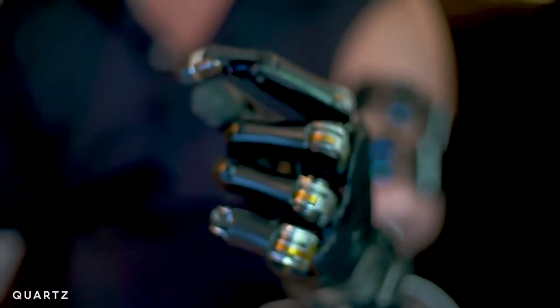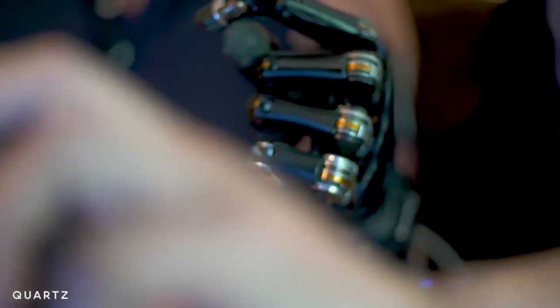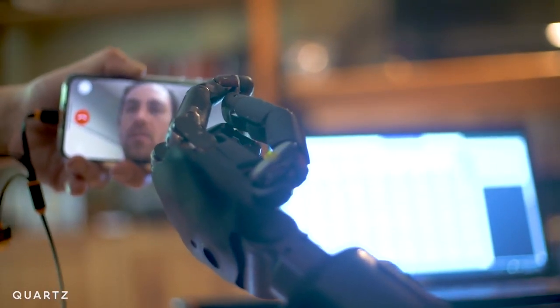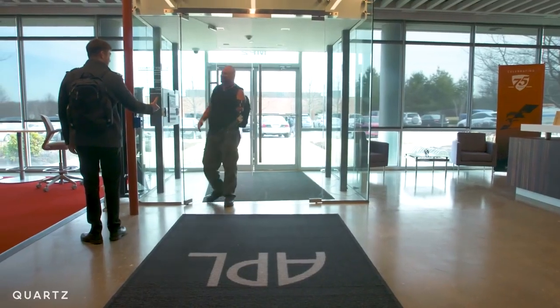This is also how they update the arm with new hand movements and adjust things like speed. Here, Johnny's having an issue with the pinch movement. The thumb is going down under the tip of the finger. Yep. Sometimes Robert needs a closer look. Alright, so that's... It's kind of remarkable to watch, and they solve a lot of problems this way. That's it, right there. Bingo. You're the man, Bobby. But nothing compares to getting together in person.